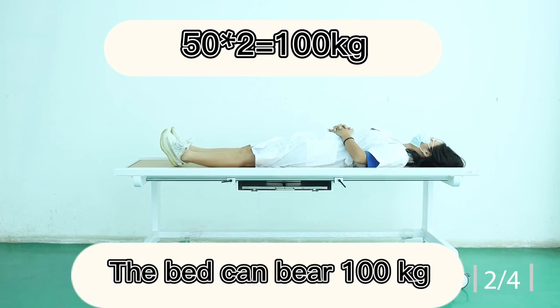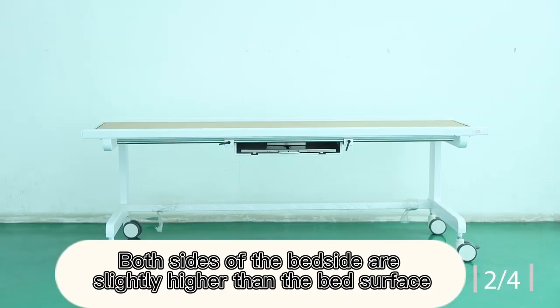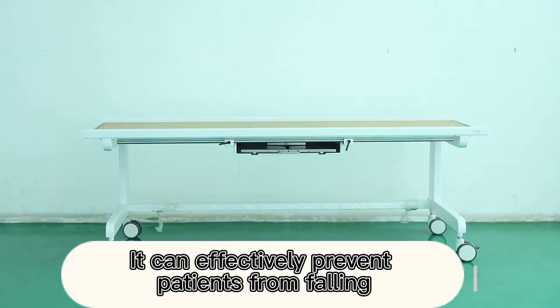The bed can bear 100K. Both sides of the bedside are slightly higher than the bed surface, which can effectively prevent patients from falling.